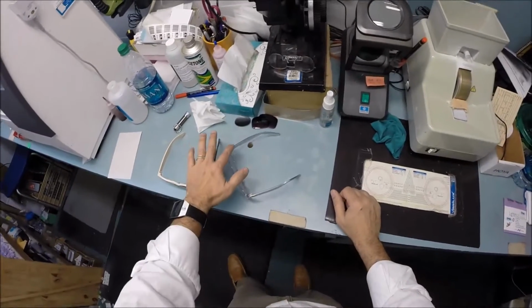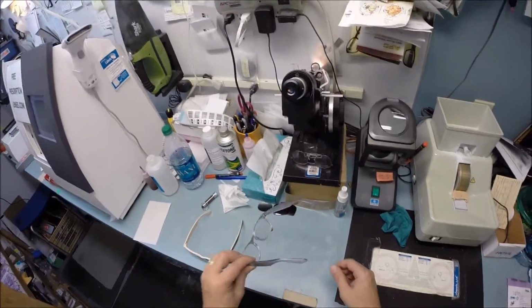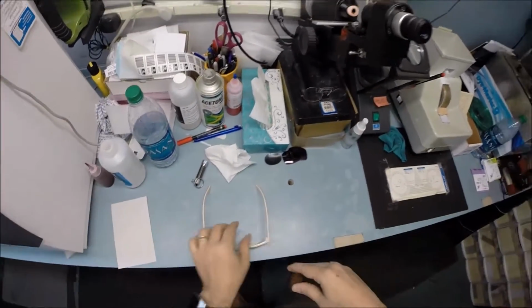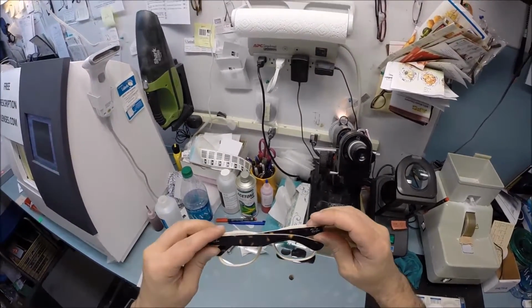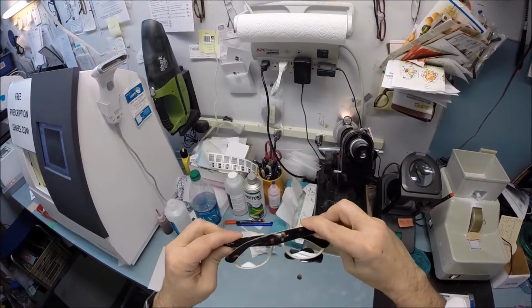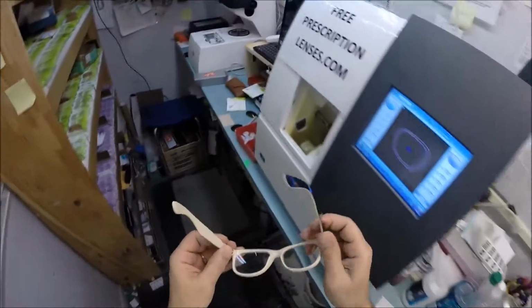There is no wobble. When I say wobble, I'm part of that 80%. I have one ear that is higher than the other. So that's why they do not sit level on the counter, but they sit level on me. So let me put mine back on so I can see what I'm doing, yo. Now I'm going to flip it back over, press down. There is no wobble. I make sure that each temple overlaps perfectly and they're not askew in any way whatsoever. That is made perfectly. I check the tension on each hinge to make sure that's matching as well.